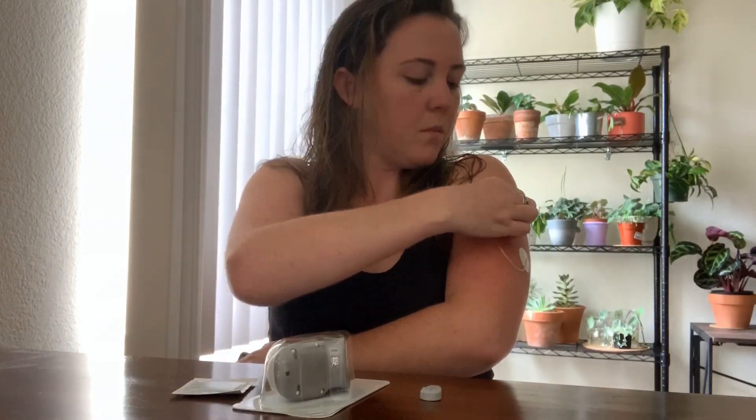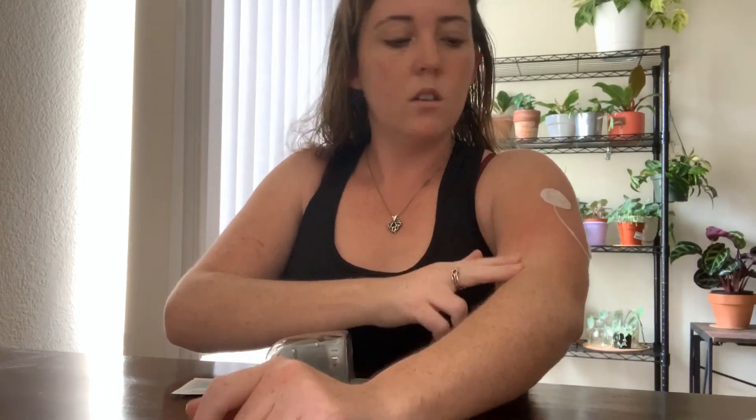I already stopped my sensor. I'm gonna take my pump off just for the purpose of not having it get in the way. I'm at an angle because I thought it'd be easier to turn and show you guys. It's red right here because I just took off my old sensor, so I'm going to put the new one just down a little bit from there.